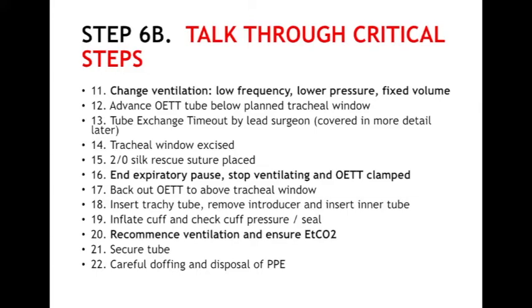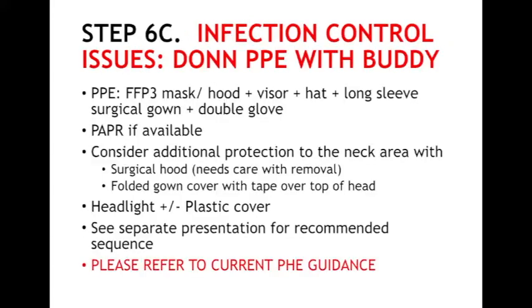The rationale for this is to minimise the period of hypoventilation for the patient, but also of paramount importance is to reduce the risk of aerosolization of any viral particles to the staff. The procedure is completed by securing the tracheostomy tube and careful doffing of the PPE. These key sequences will be covered in more detail in the following slides.